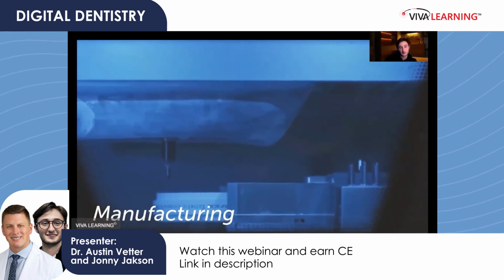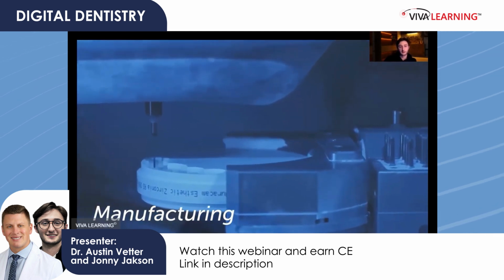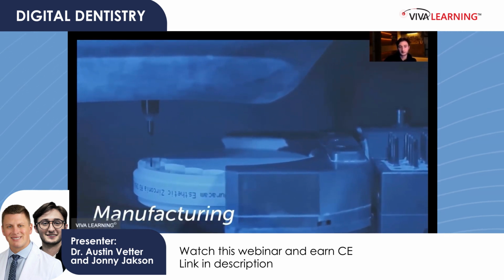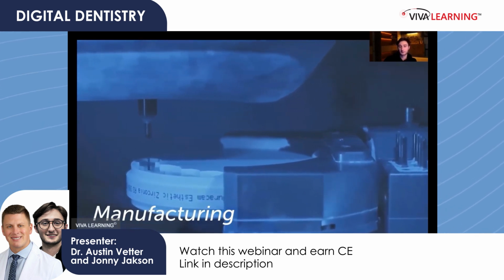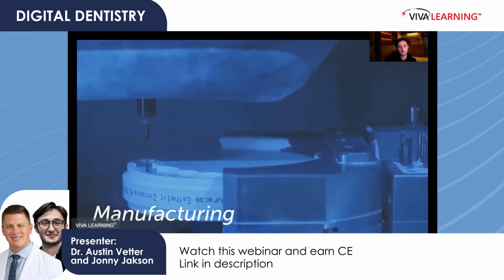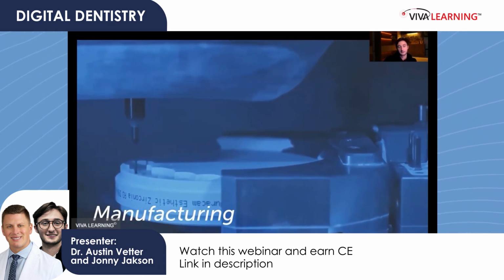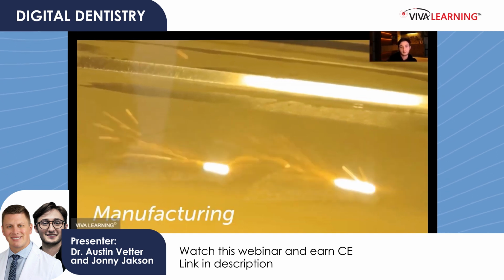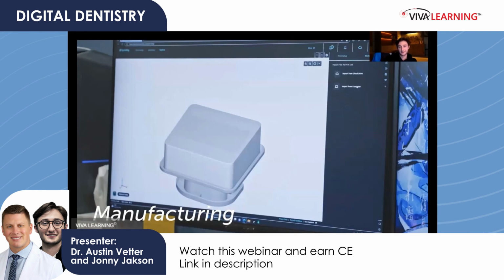Right. And so manufacturing these days looks like removal manufacturing or additive. For zirconia, that's our number one product as a modern day laboratory. Zirconia is the biggest type of restoration that we're getting. Our volume is high on zirconia and Emax, right? And then we recently acquired a metal printer, and that was just the image there.